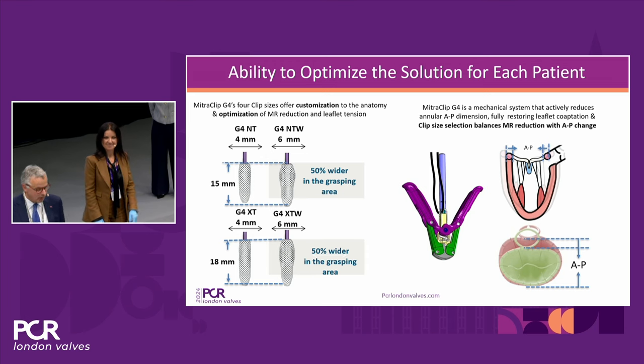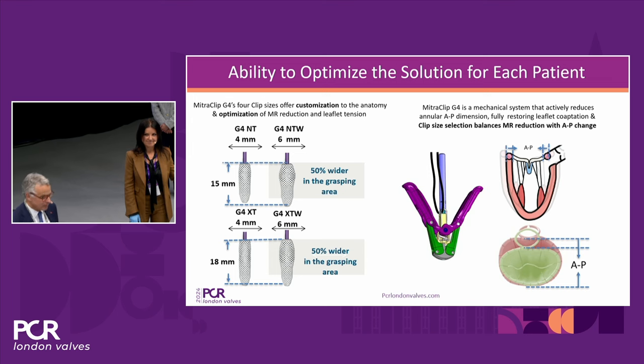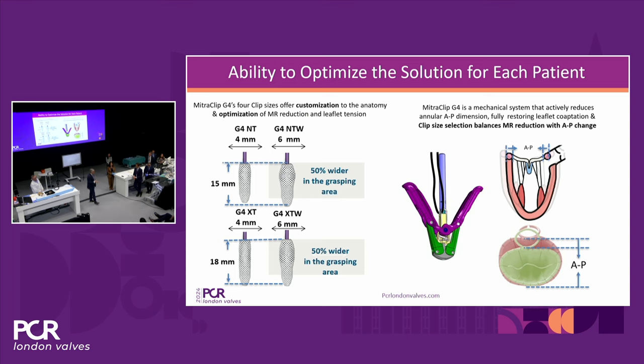In ischemic MR, maybe the MR is mainly posterior towards the posteromedial commissure, but we still go for A2P2, because even if it is not in the center of the jet, we are actually acting on the AP dimension. We are doing an indirect annuloplasty to some extent.